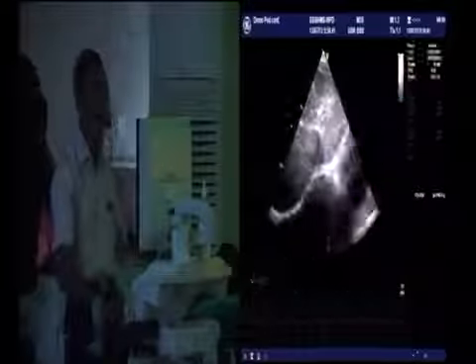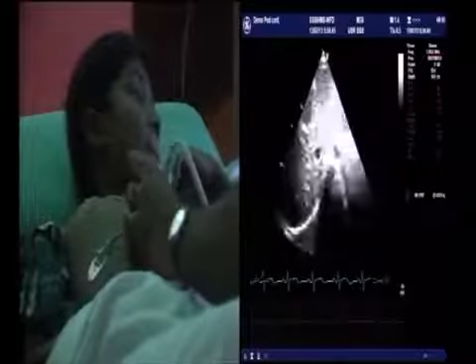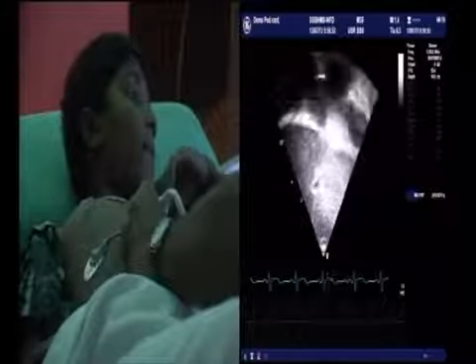Having done that, I will take away the color. I will go to the next first window. Can you get the picture in front? Okay, very good. Now I am going to show the first picture which you have to do, where the IVC opens into the right atrium.